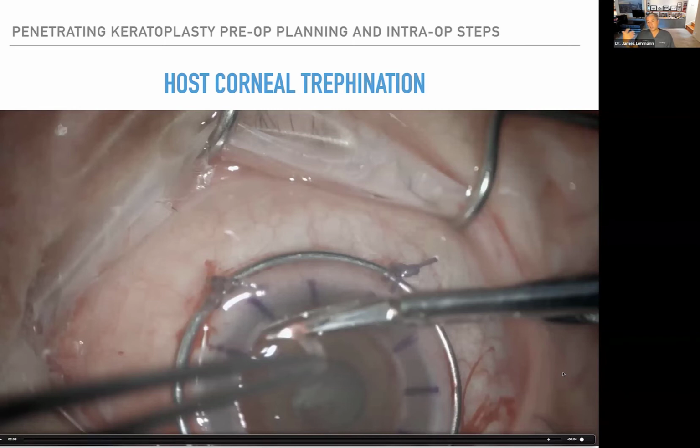But you get an idea that the cornea in the periphery, where you're cutting, is probably around 700 microns. So if you want to go down 500, once you hit the epithelium, you could probably do about 8 to 10 quarter turns. You just have to be looking all the time for any fluid coming out, and then you would stop at that point.